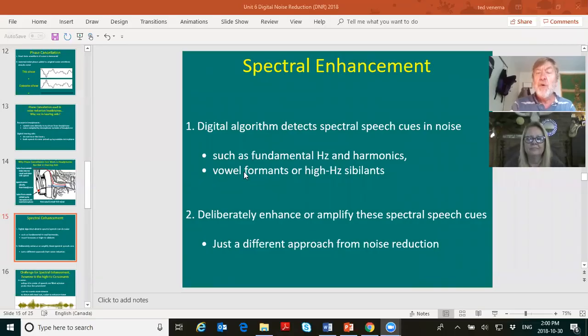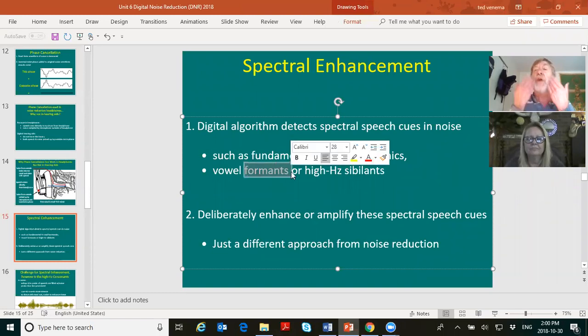Okay. And then, what are formants? That word, formants. When you look at that word, those are resonances of the vocal tract. Resonances of your vocal tract, your throat. Okay, so formants are resonances of your face. Okay, and it's kind of an interesting one to look at, but at any rate, the hearing aid's going, hey man, does it have resonances that are typical to speech?